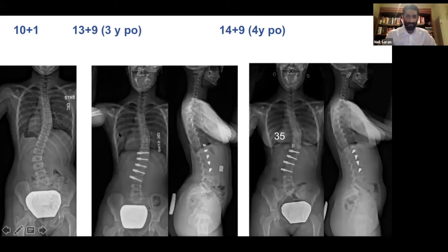So I took her back, actually removed that screw, and then I cut the cable out here. I didn't want to chase out this screw just because I was getting down towards the lumbar level and the diaphragm was there, and I just wanted to make a small incision for that. So I cut the cable there. So I really just left the cable in these 2 segments.